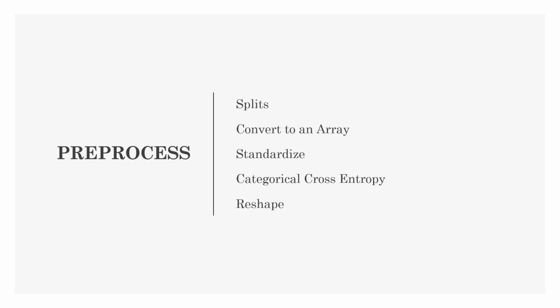Train test was split 80-20 and the remaining train set was split 87-13 train validation. Changing to an array was necessary because the CNN image classification requires the data be in an array. Standardizing, feature-wise standardization, that is, was chosen over normalization.